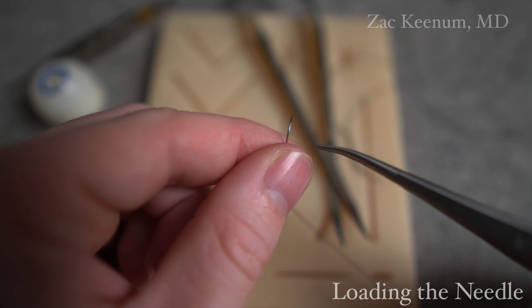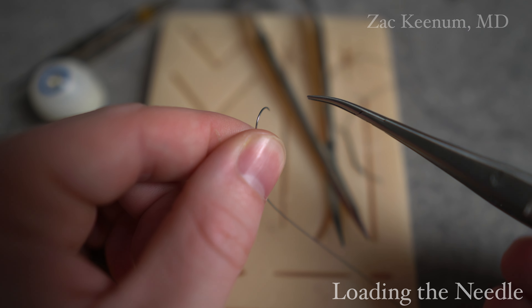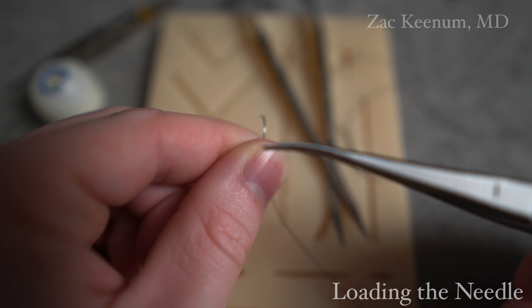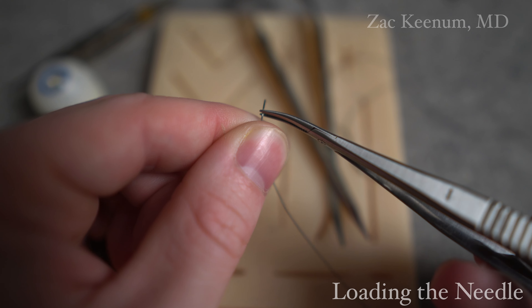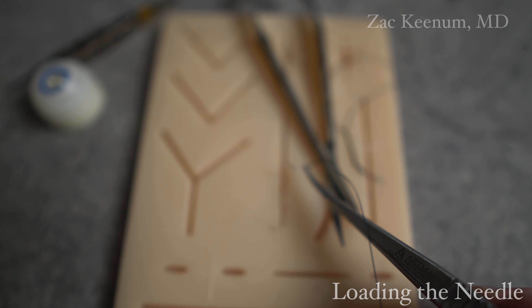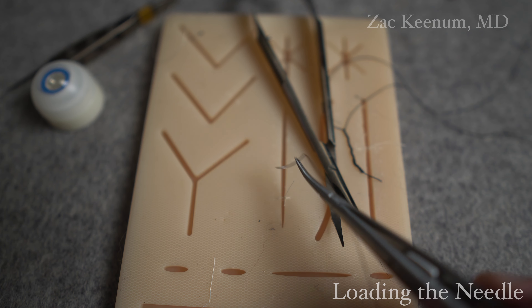FD - forehand down. So if I want to forehand, I face the needle down. The curve of this needle driver always faces toward me. So if we're going to forehand, I'm facing down with the needle. I grab about 75% of the way back. Now I'm ready for a forehand pass.